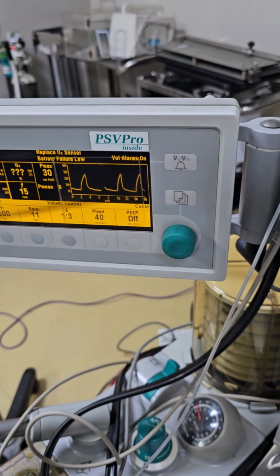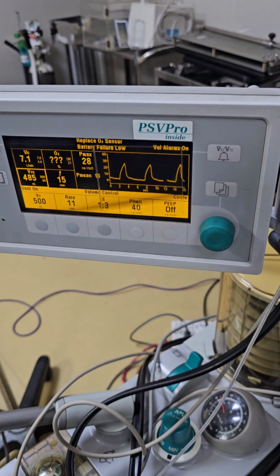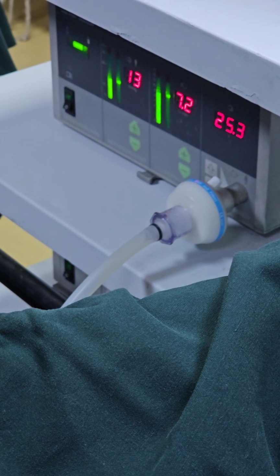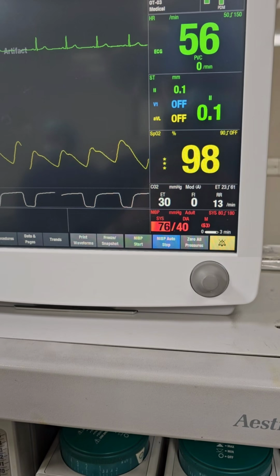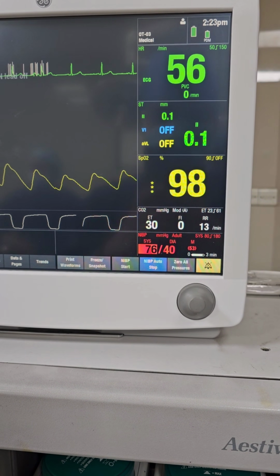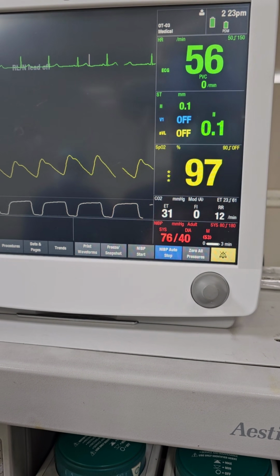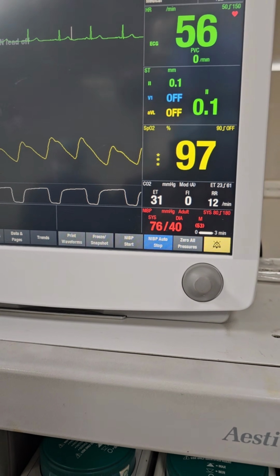We all know that. Now we have to check whether the ventilator increase is working. We are seeing the expiratory tidal volume reaches 471 ml, and we are seeing the intra-abdominal pressure fluctuating between 11 to 14 millimeters of mercury. There is still slightly low blood pressure, which remains at that period. The 3-minute interval of the NIBP is ticking ahead, and maybe we are getting it within a few seconds.